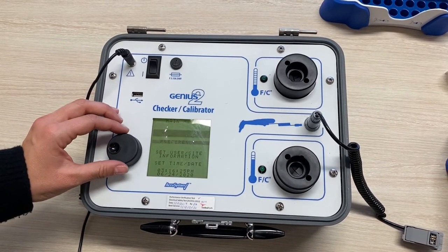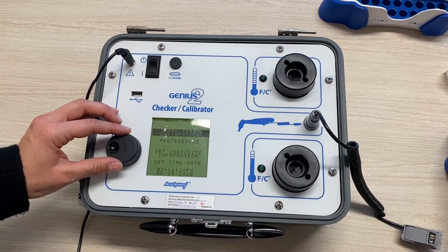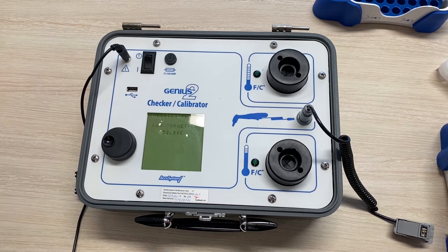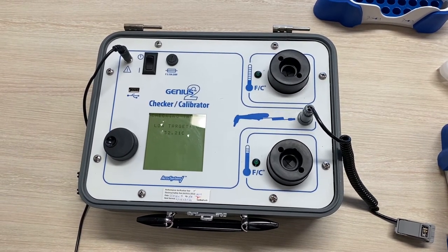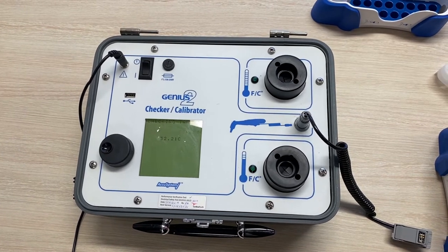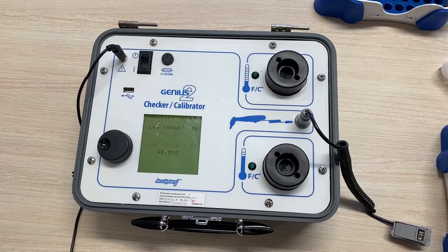You can proceed to the next step using the toggle button and pressing down on the main knob. The calibrator is now making sure the targets are stable and within specifications. As you can see, the low target is about 32 degrees Celsius and the high target is just over 40.5 degrees Celsius.